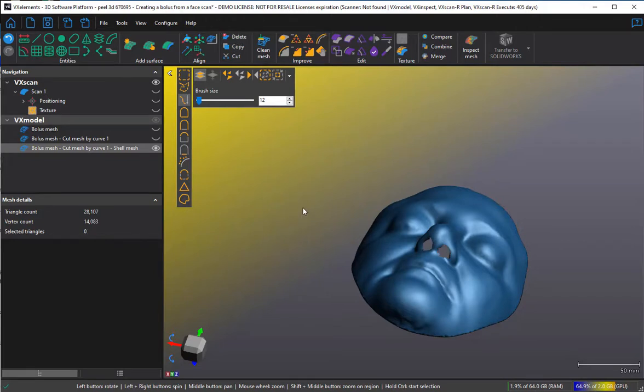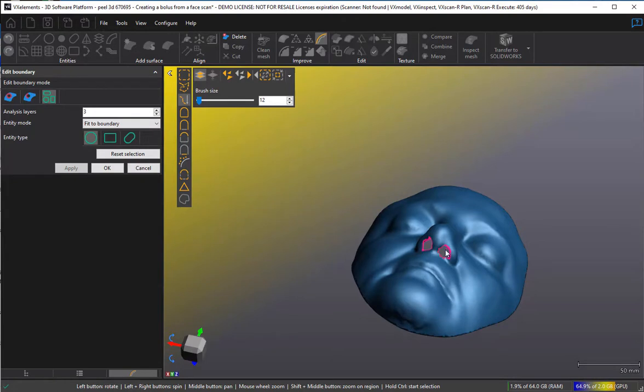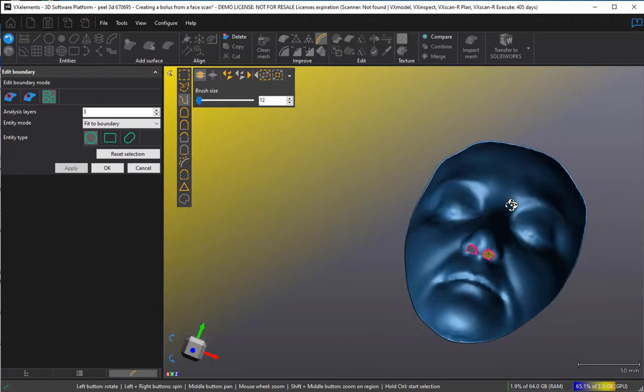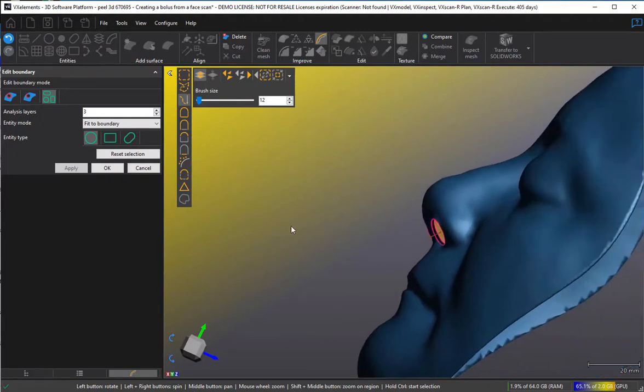If I want, I can make those boundaries a little smoother. I can tell it I want to make a circular boundary here — apply — and a circular boundary here — apply. I can turn it around and do the same on the inside boundaries — apply, apply. Now if we look carefully, we've got a hole through this shell.